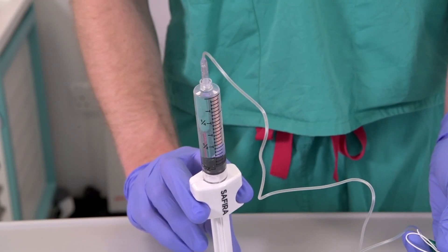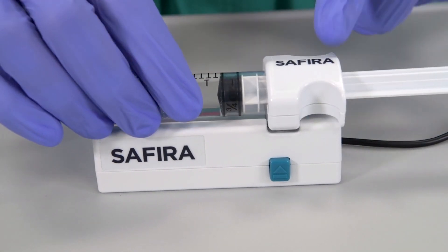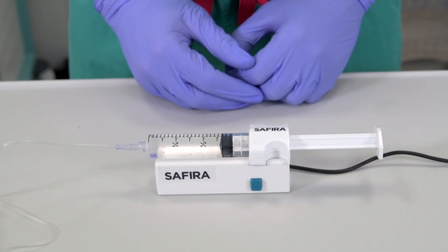Once the needle is secured, prime the needle and tubing set to remove the air, following standard procedures. Once primed, attach the syringe to the driver unit. Align the syringe with the driver unit and gently press the syringe down onto the driver. It will be seated correctly when you hear a click.